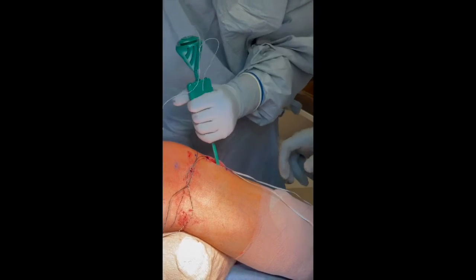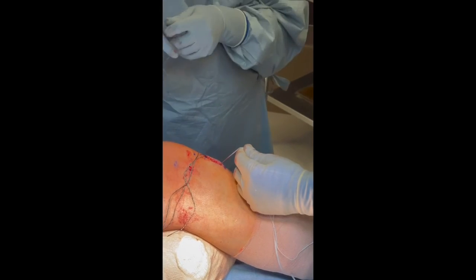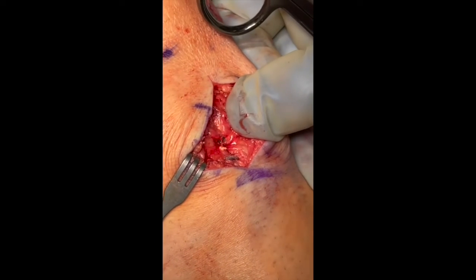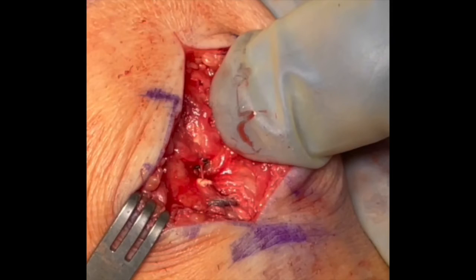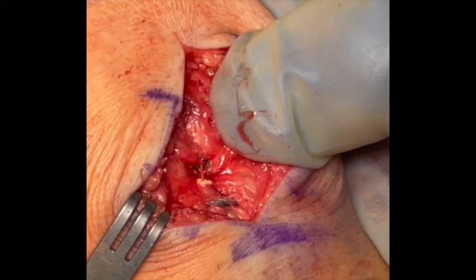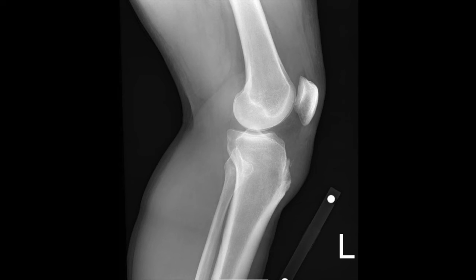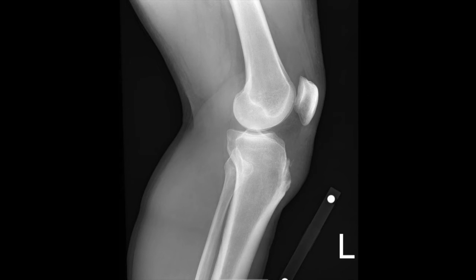Skin and subcutaneous tissues are closed in routine fashion. The patellar incision is copiously irrigated and closed in a layered fashion using 2-O monocryl and 3-O monocryl subcuticular sutures. The portal incisions are closed using a 3-O monocryl subcuticular suture.